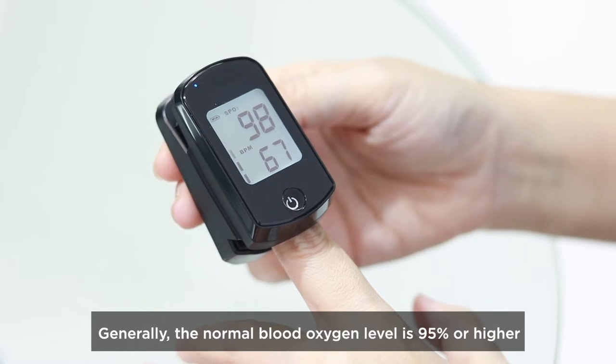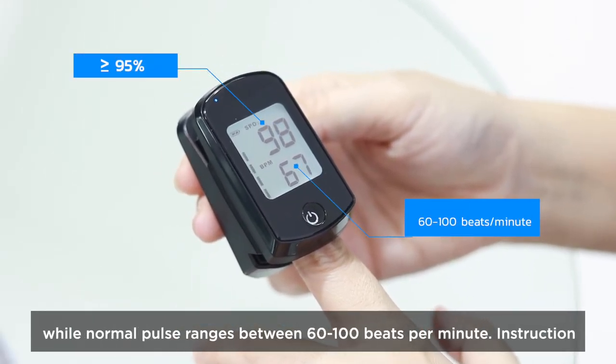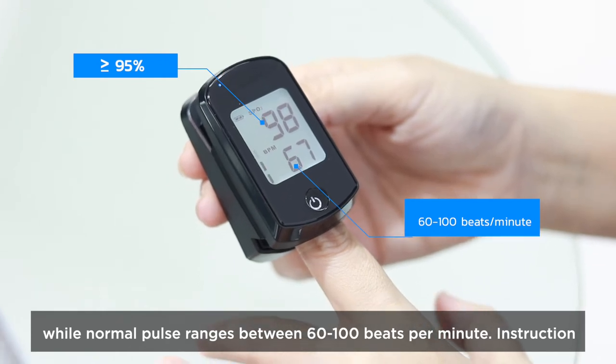Generally, the normal blood oxygen level is 95% or higher, while normal pulse ranges between 60 to 100 beats per minute.